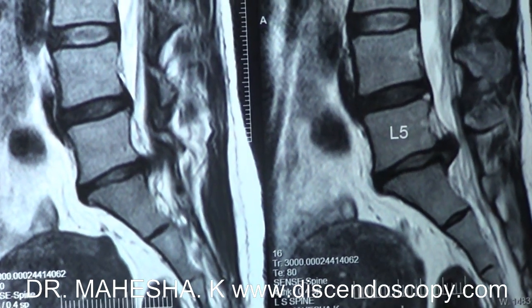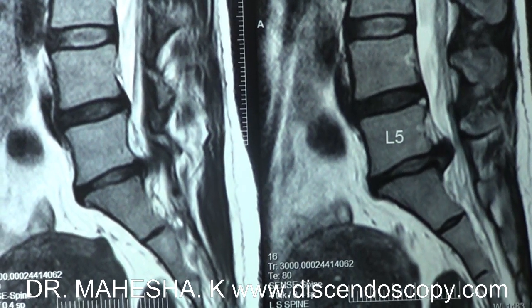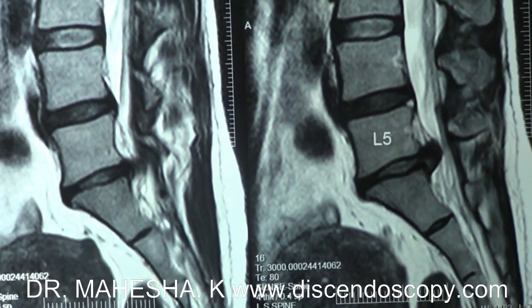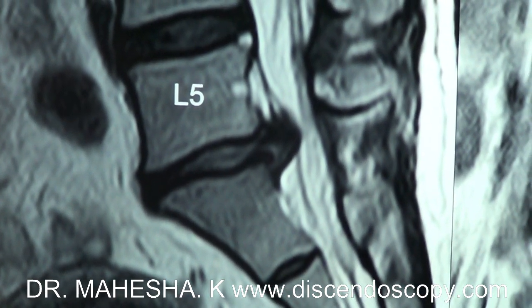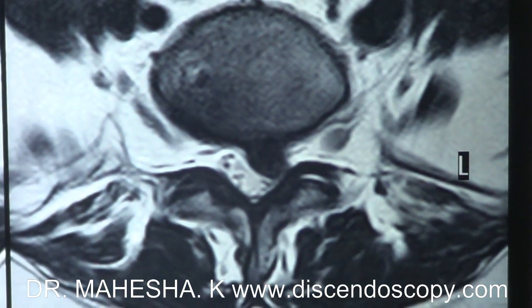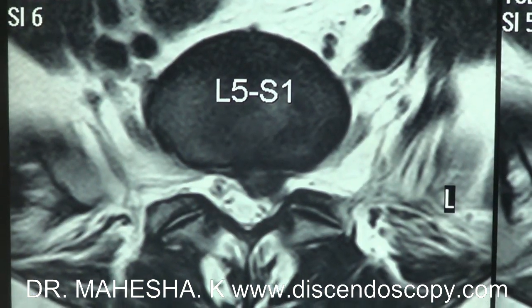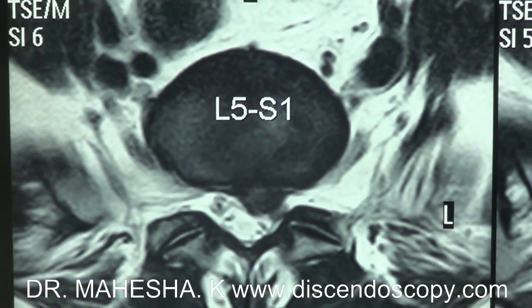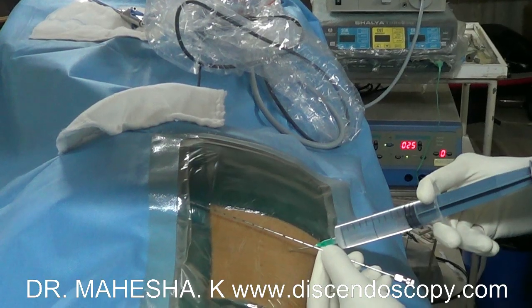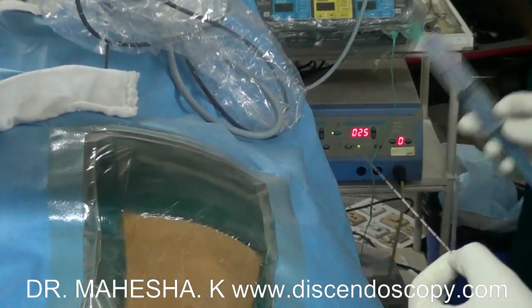Hello, Dr. Mahesh here. I am going to show a case of transforaminal endoscopic disc removal for L5-S1 disc herniation. This patient presented with left S1 radiculopathy since one month. Pain was severe and affecting activities of daily living. The MRI shows a central disc extrusion at L5-S1 causing compression of the nerve root on the left side.